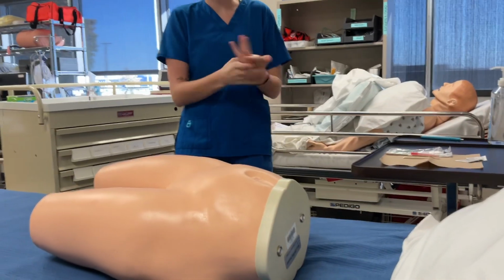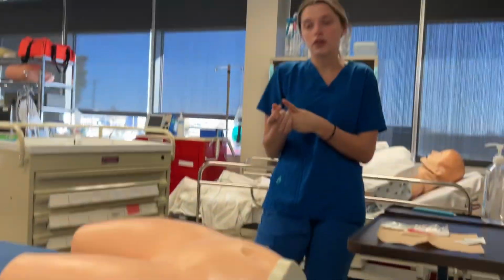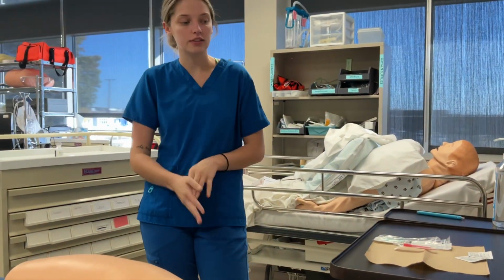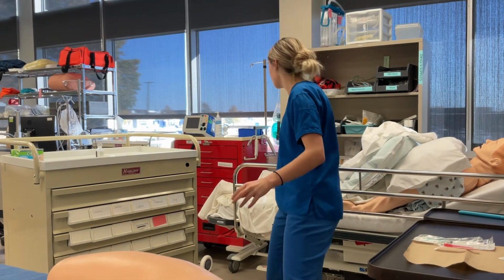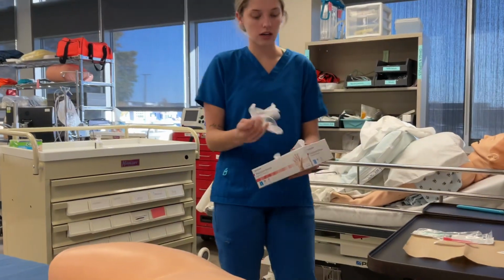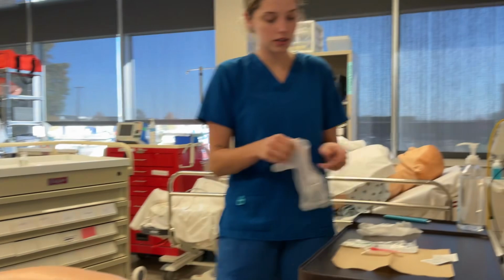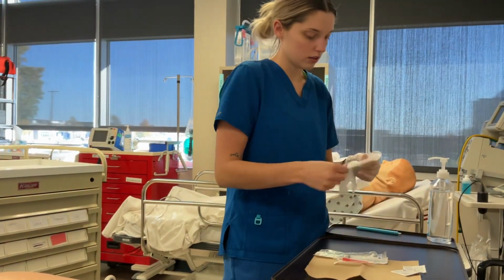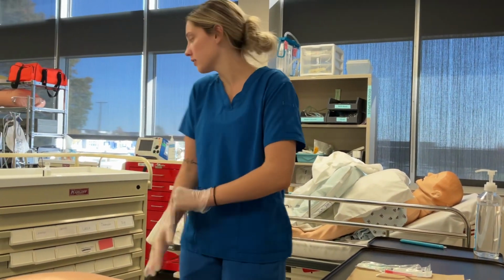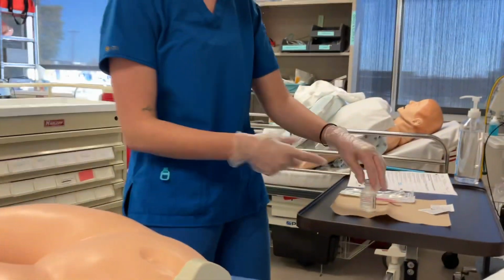Today your provider ordered we do a ketorolac injection. So that just entails me telling you a little bit about the medication, telling you why it's used, having you teach back, and then giving you the injection. Today for PPE, I need normal gloves. So I'm gonna put those on now. Do you have any concerns before we begin? All right, so first I'm just going to scan your wristband and the medication.